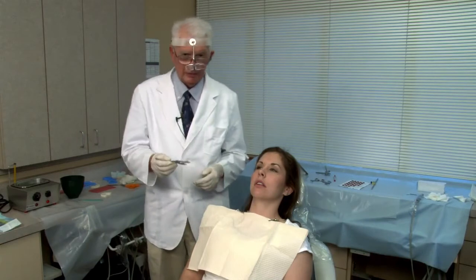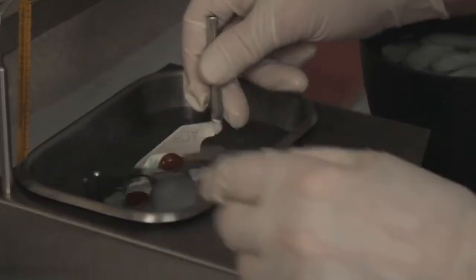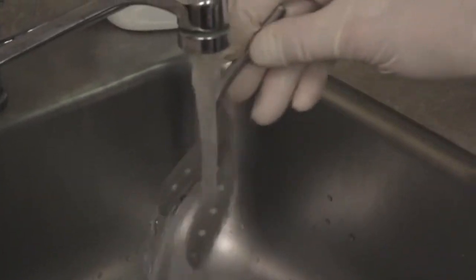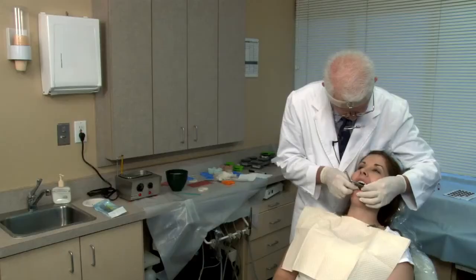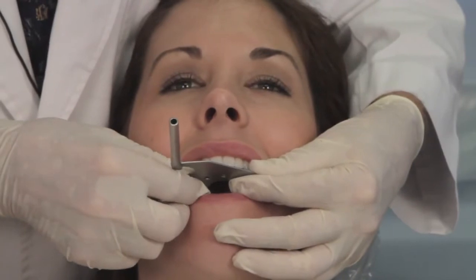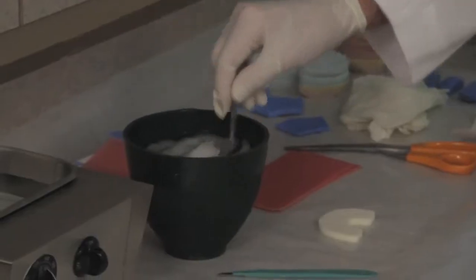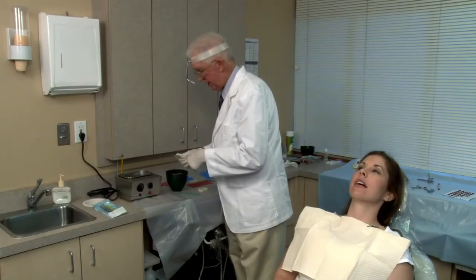But first I have to get my bite fork ready, the same as before. I just checked to see how soft the compound was. Chill the bite fork so it's not hot, and set the base of the compound. Put it against the teeth, line up the midlines. Chill it. Look at it and see if you need to trim the compound.